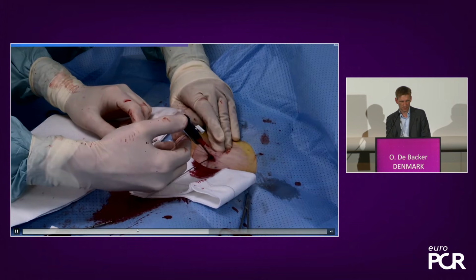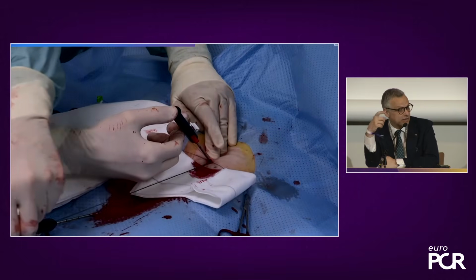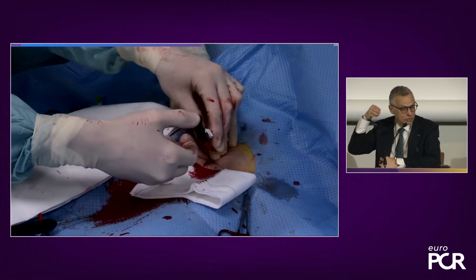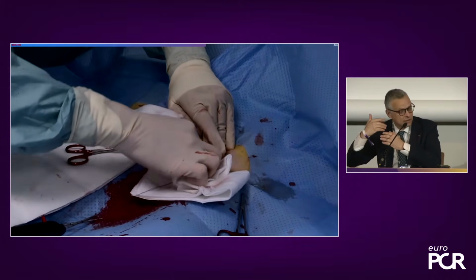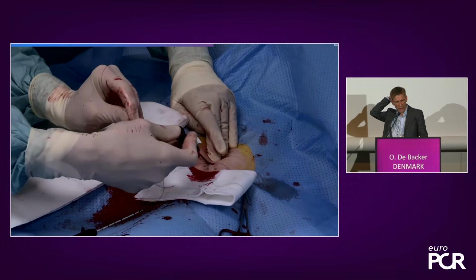So really, there is no reason to do this maneuver, down. There is no reason, because there is a knot which is pre-prepared in the system. And it's a sliding knot, a fisherman's knot that goes down and locks automatically. You have to do a nice and continuous maneuver. So then the last thing before we did this, so now I pushed on both long ends.